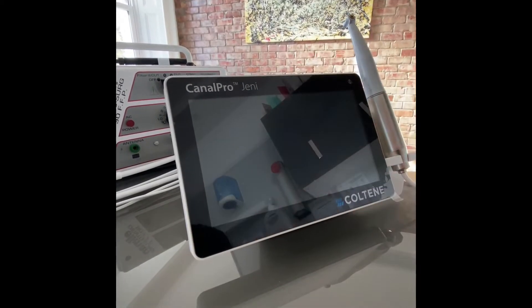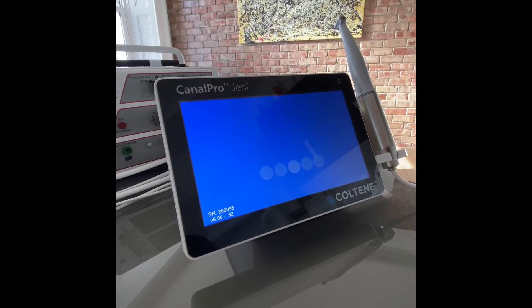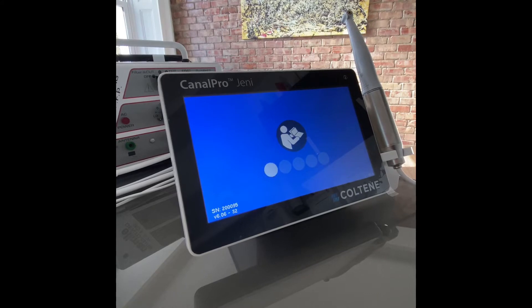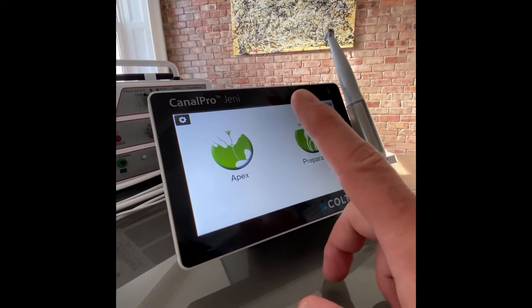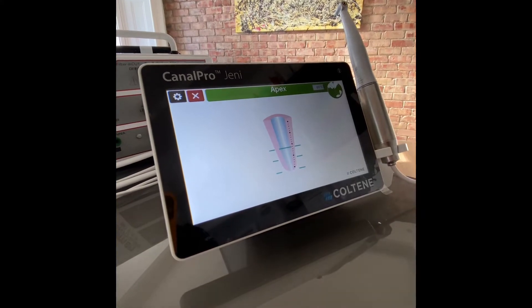It's also an open system — you can use any file with the doctor's choice option, even on continuous rotation or reciprocation movement where you can choose different angles. Jeni is a cordless tabletop motor with a built-in apex locator and a 7-inch touchscreen that is simple and user-friendly.